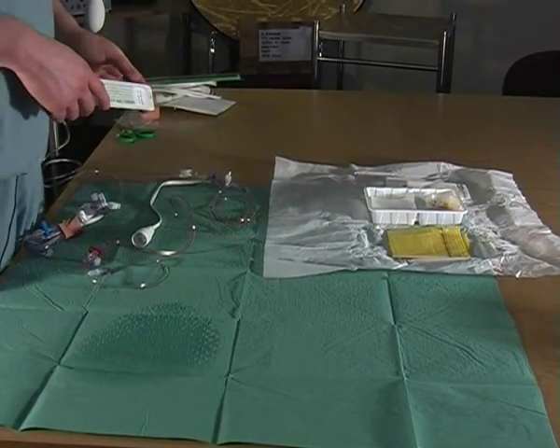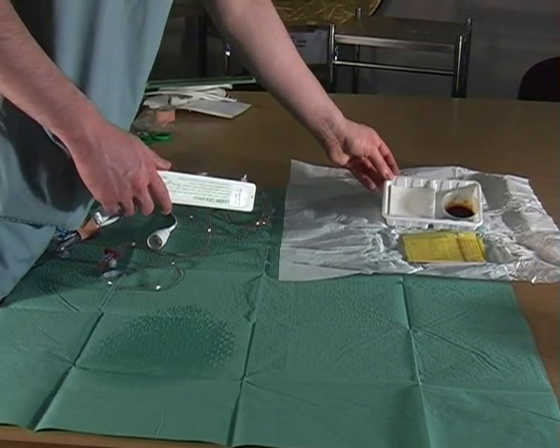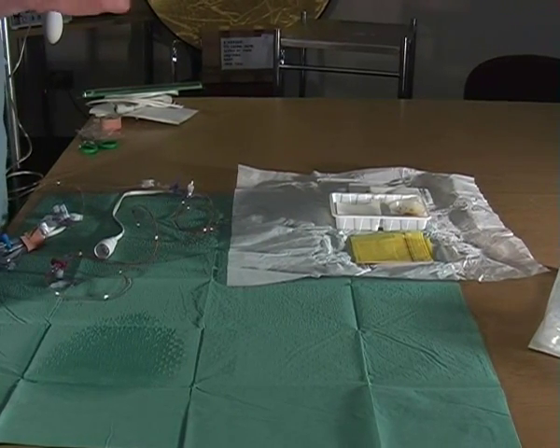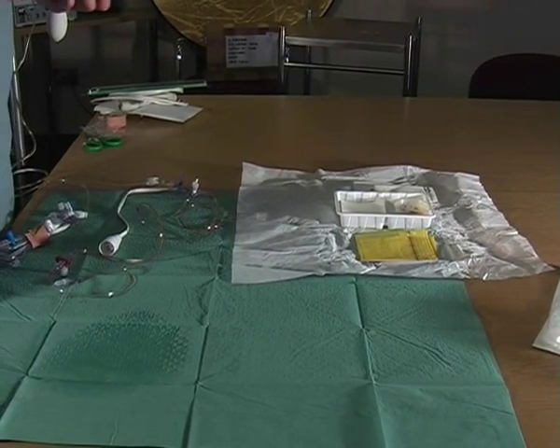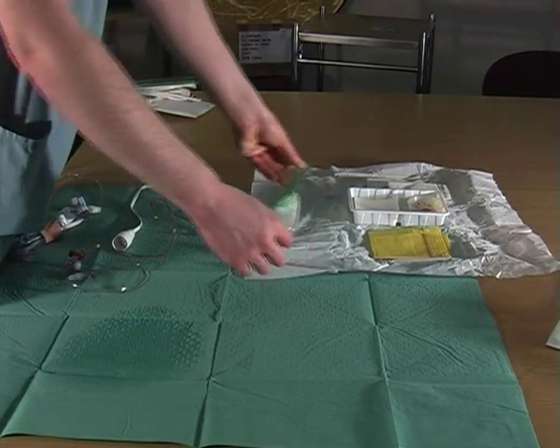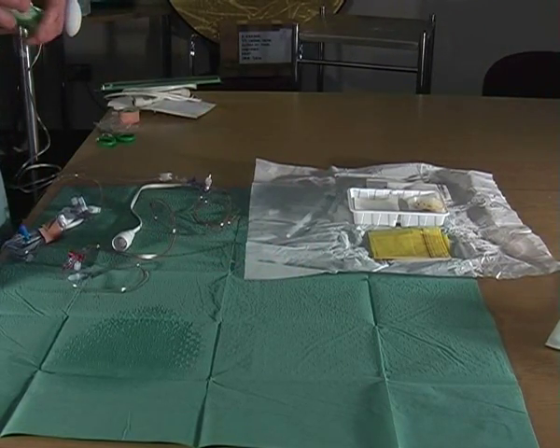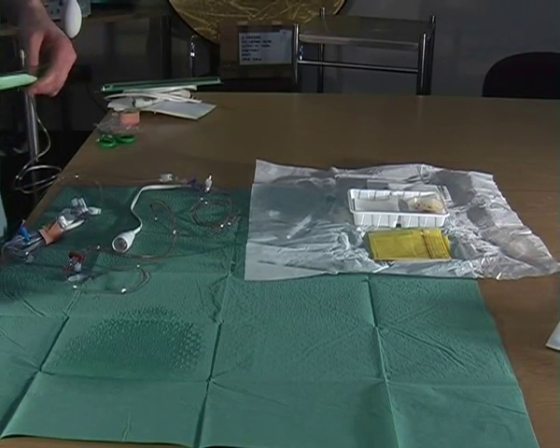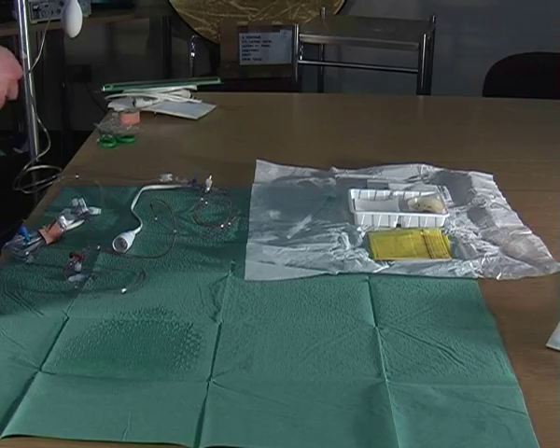Open your dressing pack. You can use iodine or, as an alternative, you can use chlorhexidine 2%. Open your arterial line onto your dressing pack. That is now ready for the doctor to insert into the patient.